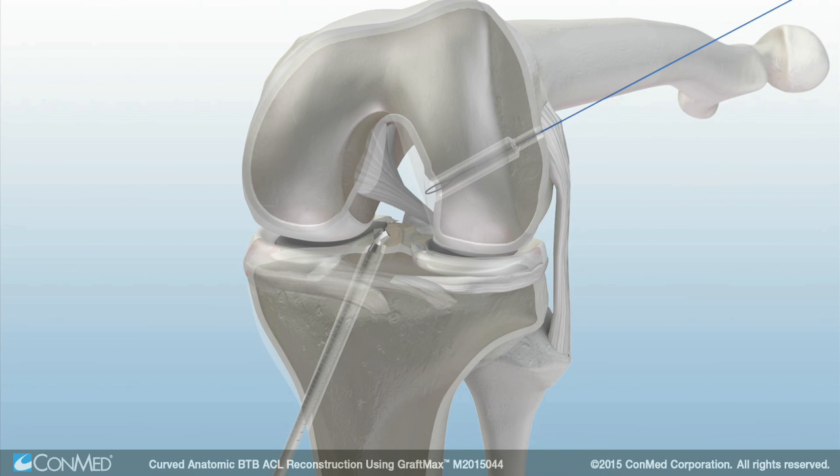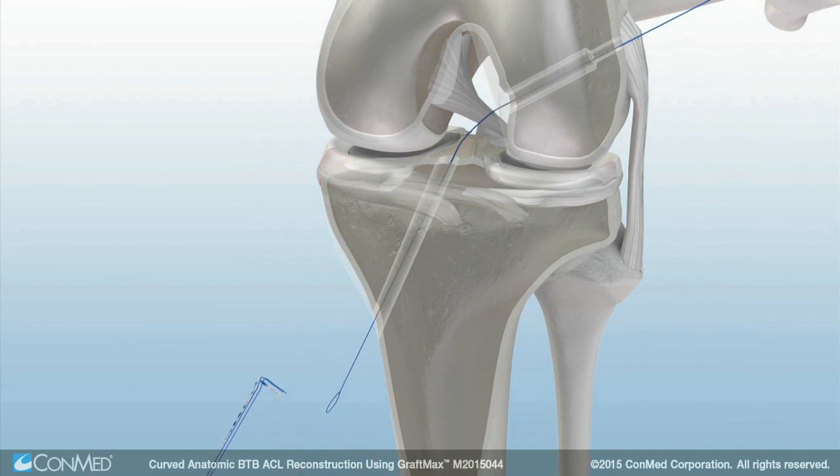Ream the tibial tunnel. Then retrieve the passing suture through the tibial tunnel. Load the blue and striped suture tails of the GraftMax button into the passing suture.